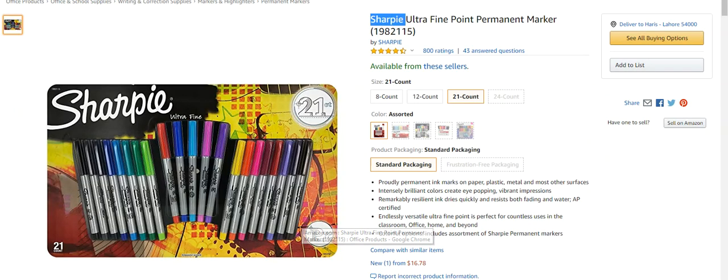Before going into the superimpositions, I will let you know about some necessary things which you should have for making the superimposition. The first one is ultra fine permanent markers. I usually prefer them from Sharpie. For structural superimposition, you will need black for initial, blue for mid if there is a mid treatment, red for final, and green for post retention or follow up.